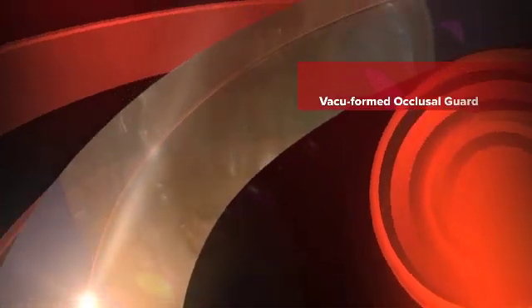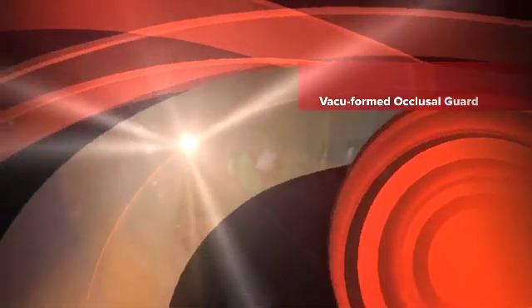This is Dr. James Dillap with the University of Colorado School of Dental Medicine with a video snippet on the fabrication of a vacuformed occlusal guard.